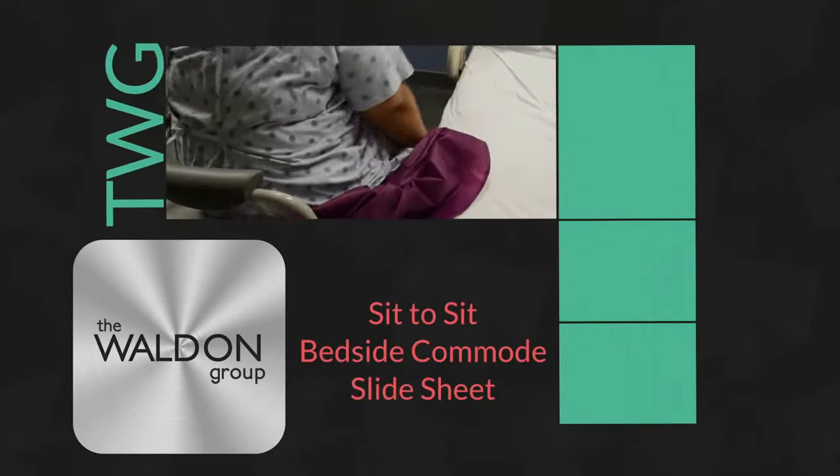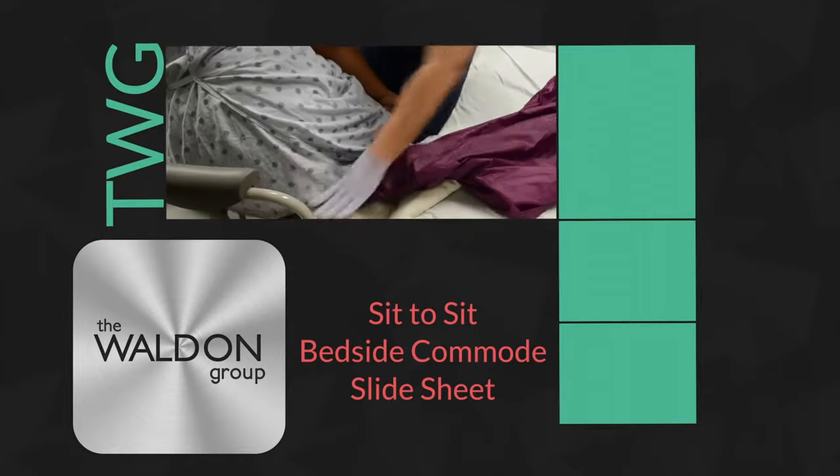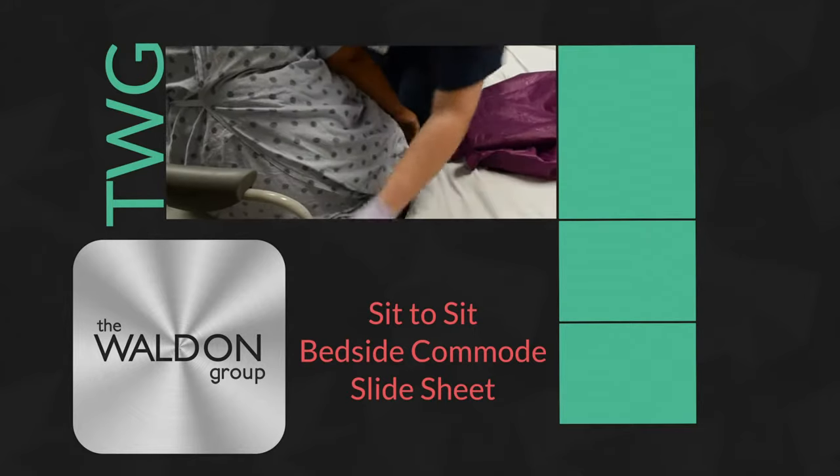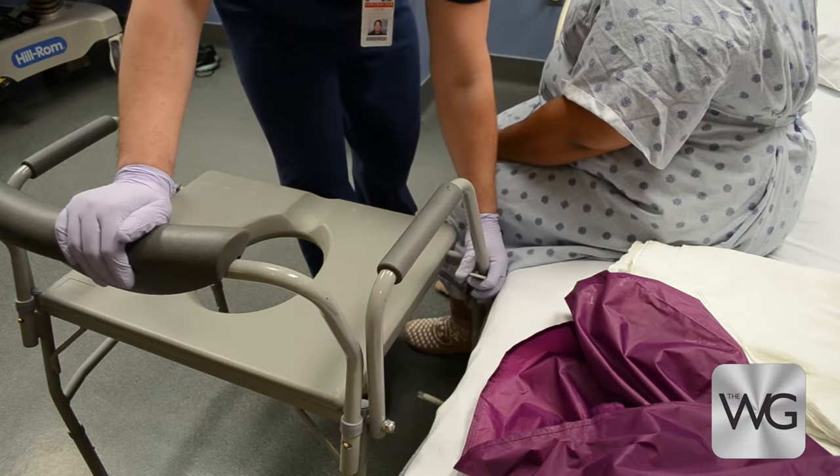If the patient is able to sit on the side of the bed unsupported for five seconds but is not able to stand, caregivers may utilize a drop-arm bedside commode to assist the patient with toileting needs.